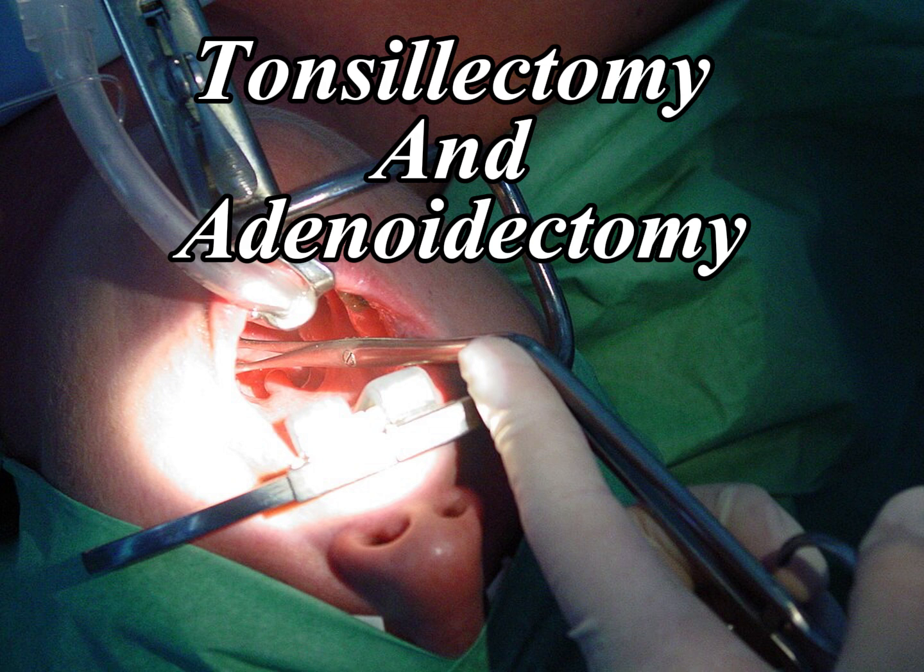Step 4. Final inspection and hemostasis. The oropharynx and nasopharynx are suctioned clean, and the entire surgical field is inspected for residual bleeding or tissue. No sutures are usually required. The mouth gag is removed, and the patient is awakened from anesthesia with care to minimize coughing or straining, which could dislodge clots. Postoperative care.